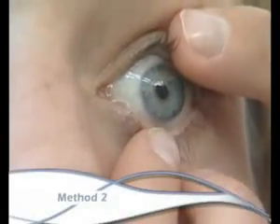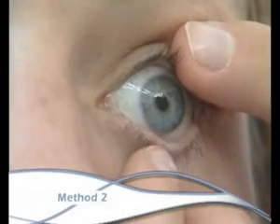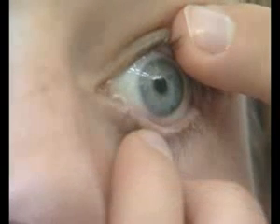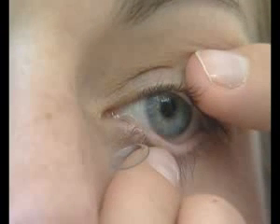With the head tilted forward, place the right index finger on the bottom eyelid and lashes, with the left index finger on the upper eyelid at the lashes. Open your eyes wide and bring your fingers in, exerting enough light pressure to free the lens from the eye.